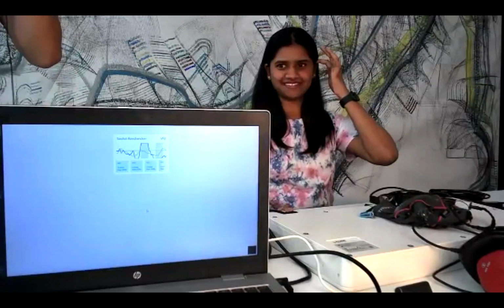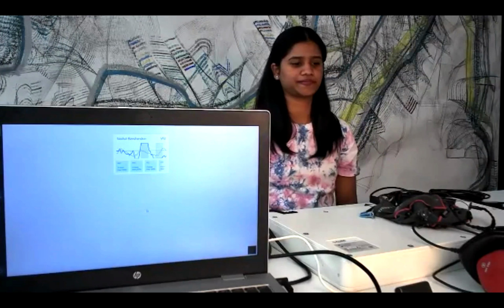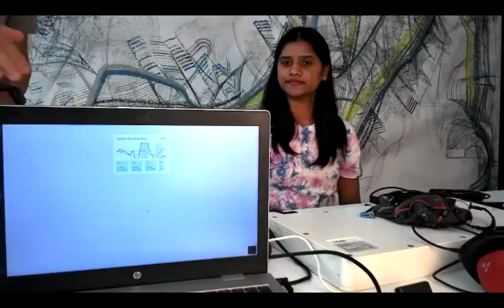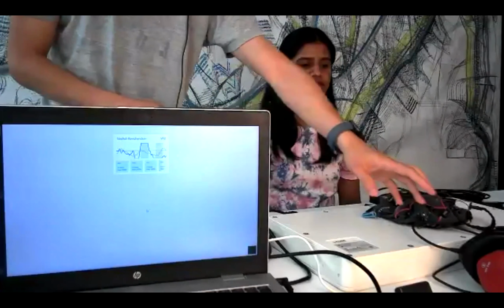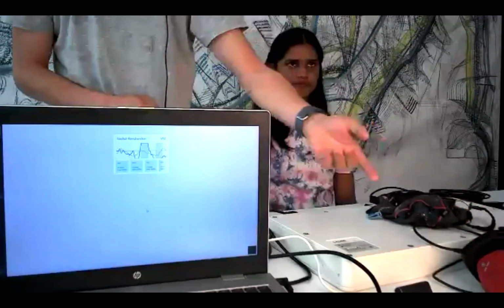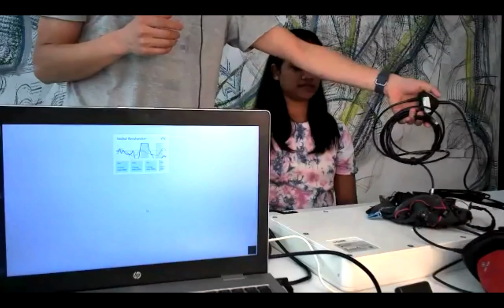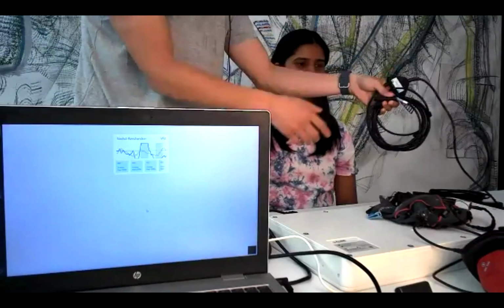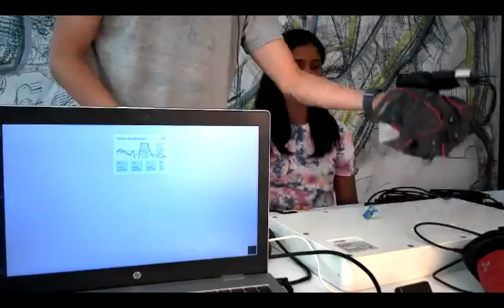Okay. And before that, I also want to show you a little bit about the mindBEAGLE. I think you can see it here, probably, the mindBEAGLE laptop. Here is the cube we have on the headphones that's used to deliver the auditory stimuli. And I don't know if you see, yeah, probably you can see here the vibrostimulus we use to deliver the vibrotactile stimulation. And of course, we have the EEG cap here.